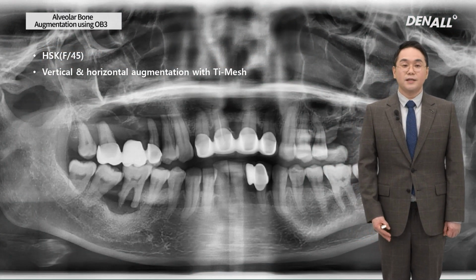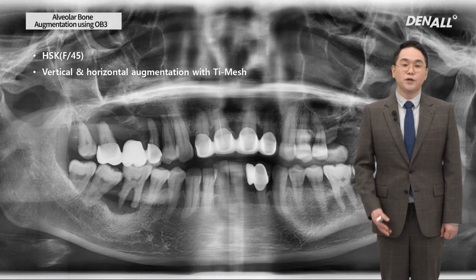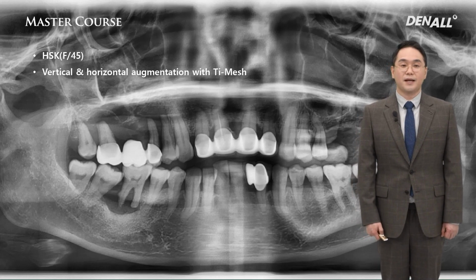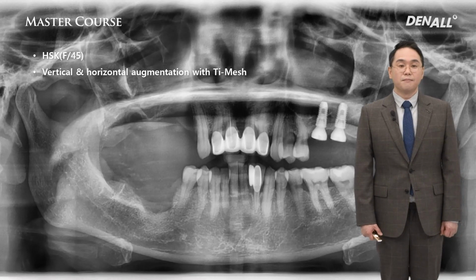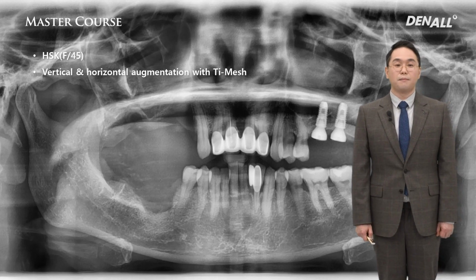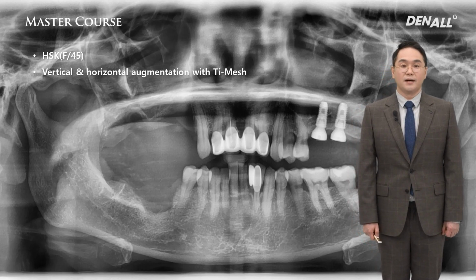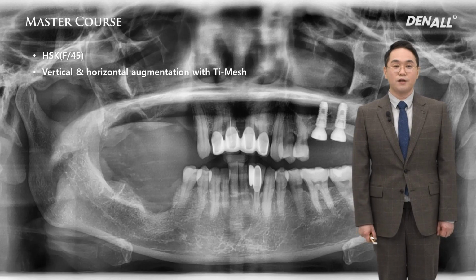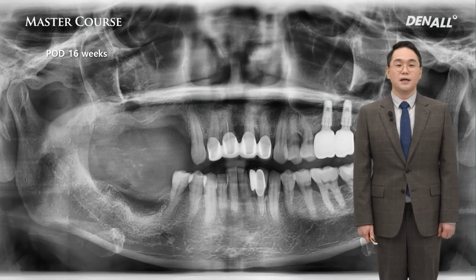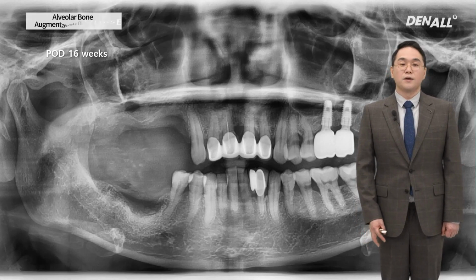45-year-old female, chief complaint due to severe period disease. Overall, there is teeth mobility and a defect at number 26 and 27. First, upper right posterior teeth are extracted due to severe mobility. Waited until soft tissue healing. In the meanwhile, 2 implants are placed at number 26 and 27. And prostheses were delivered after occlusion is established in the left posterior.